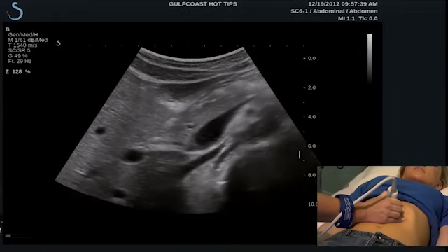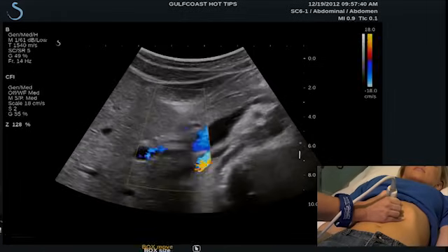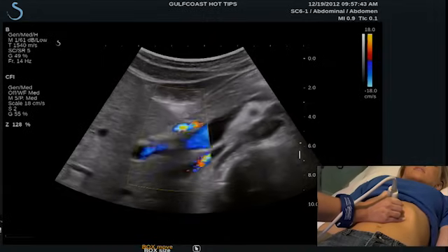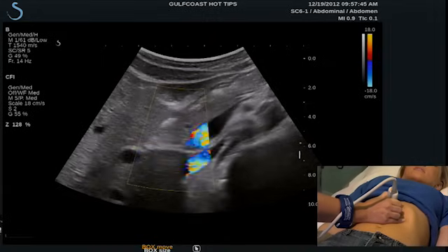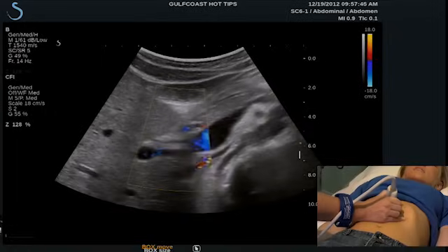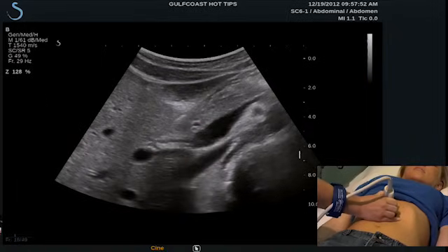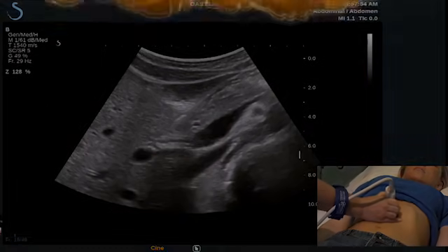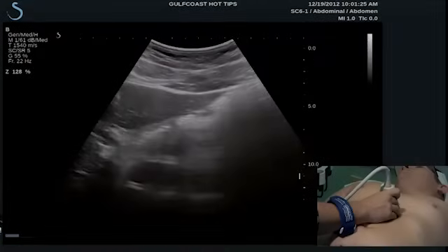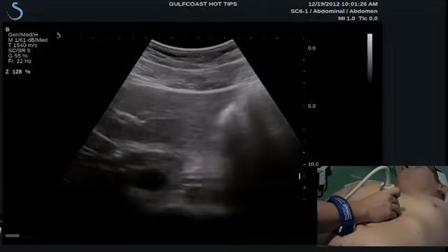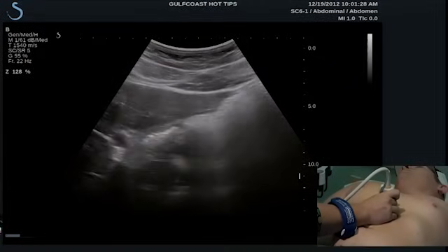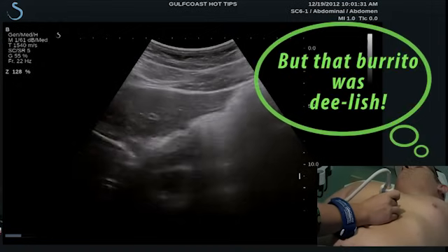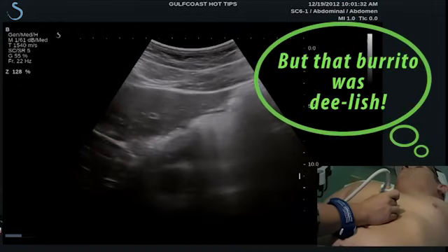Also remember, if you're struggling to tell the difference between the common bile duct and the hepatic artery, color can always help. Now let's look at a patient with a more generous body habitus. You can see with this patient, we have a lot of bowel gas, something we more typically see in our patient population.